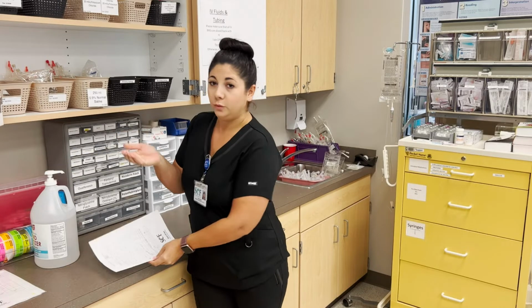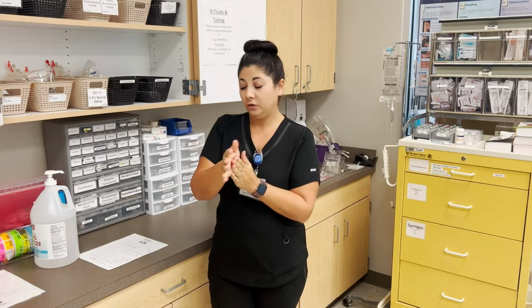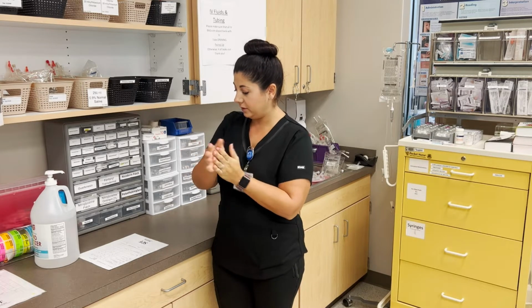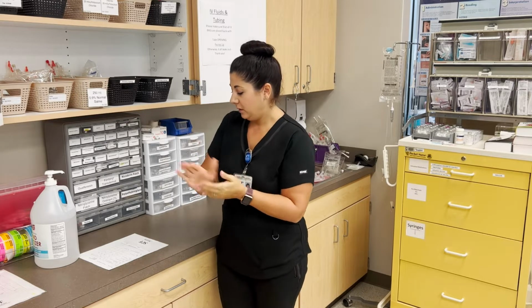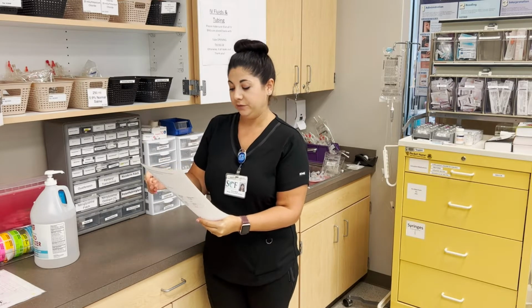I'm going to wash my hands. And then look at my MAR, making sure that I have the correct patient. Their name and their date of birth are on there and are correct. I'm looking at their allergies to ensure that I'm not giving anything that they might be allergic to. I am looking at the time and determining which of these medications I need to give.